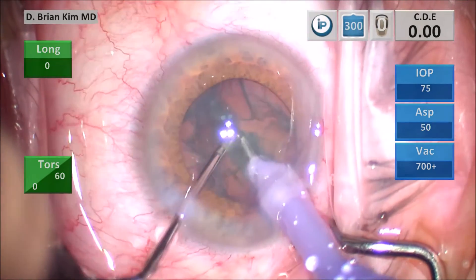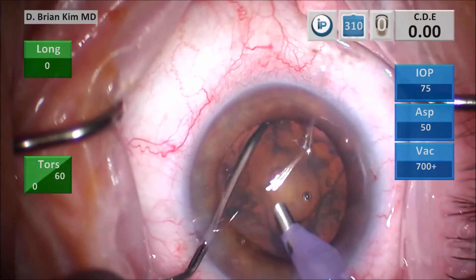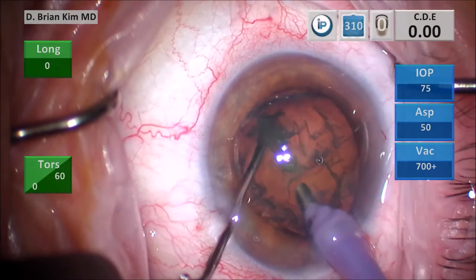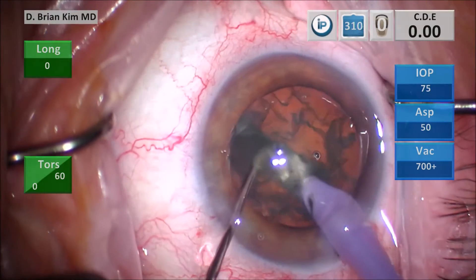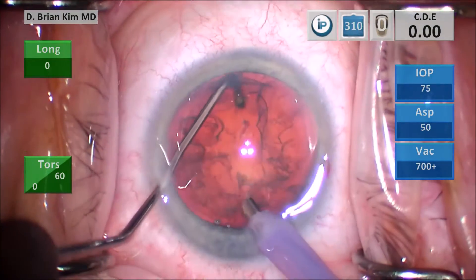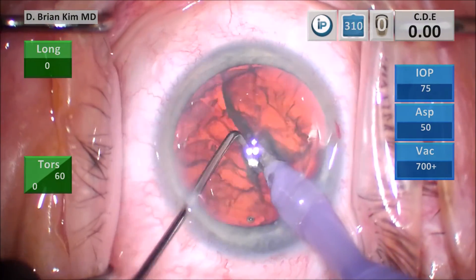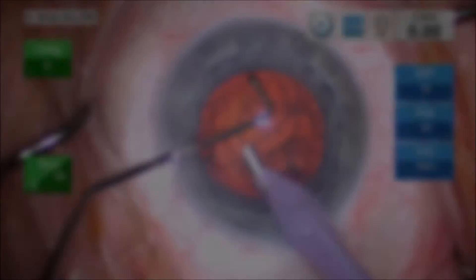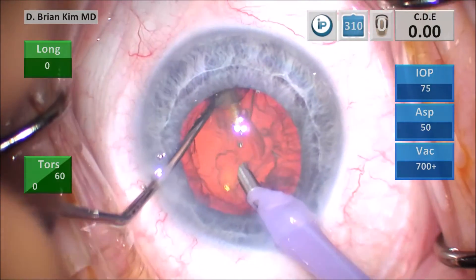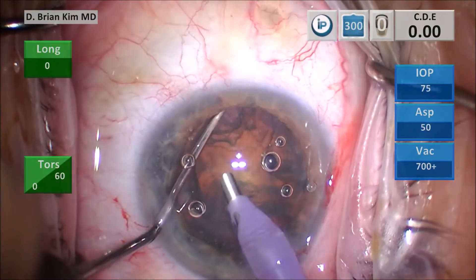I'm doing this just to show that I can lift as I perform this technique — that's not how I normally do it, but as an example of how I am not causing zonular stress. I'm lifting the lens with the chopper and then pushing the facotip into the meat of the lens and it fractures the lens. As you can see, there's no ultrasound or vacuum performed at all during these maneuvers — it's just with irrigation only. This is primarily for illustrative purposes because I am able to do this simultaneously.